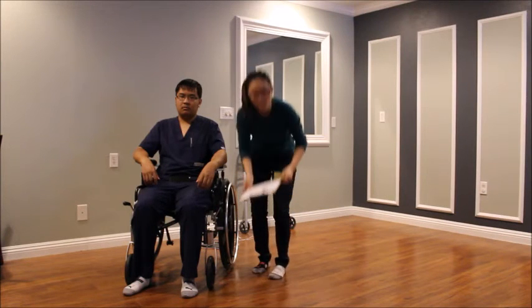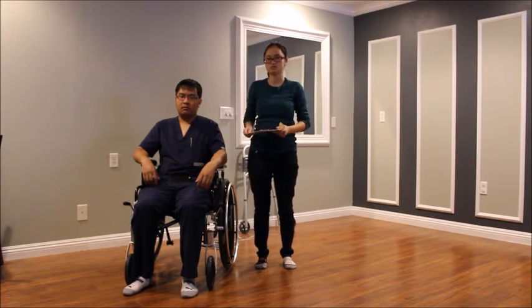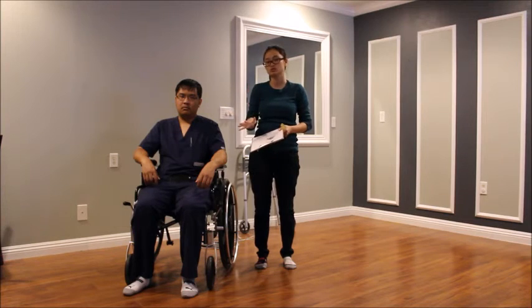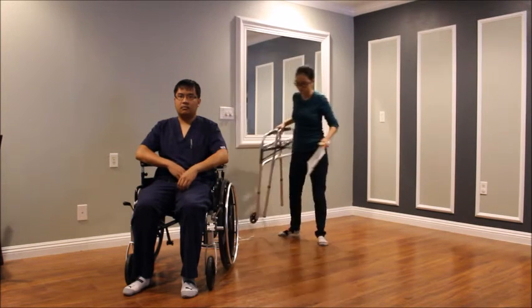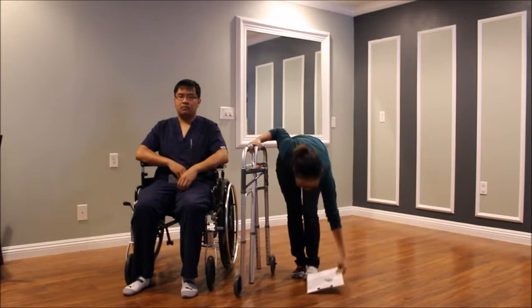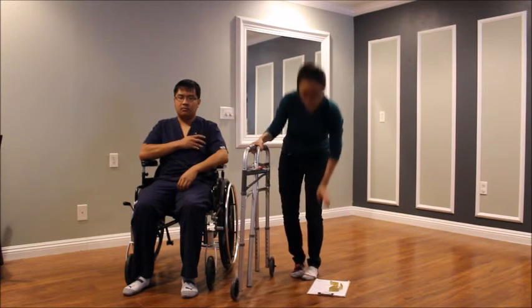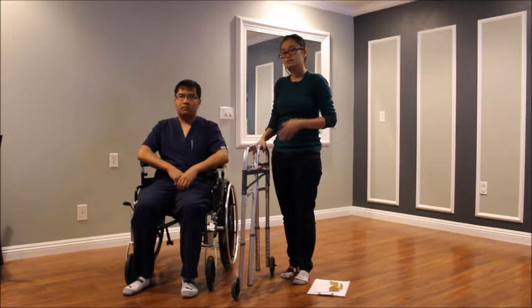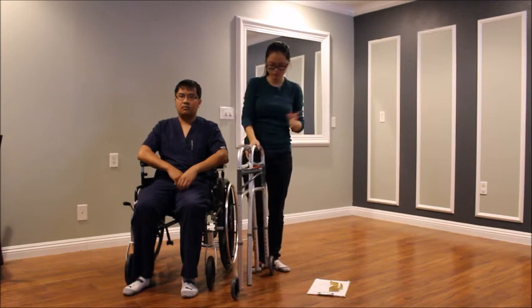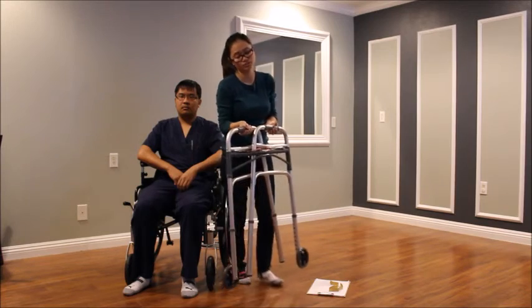We're going to measure a different device. Adaptive equipment is walker or cane measurements. Walker and cane measurements are usually the same. So canes and also walkers come in different sizes and shapes. So it's important that we need to know the measurements as well.